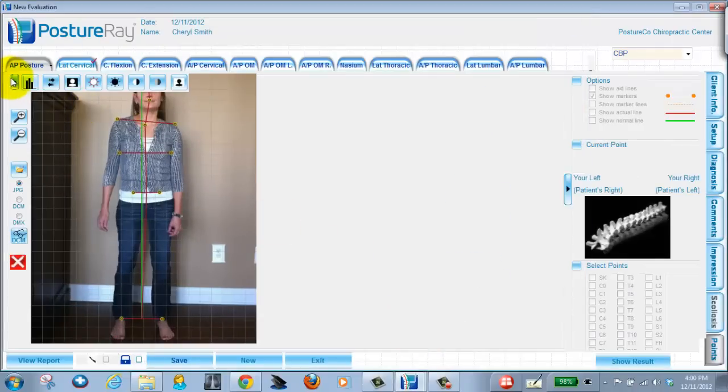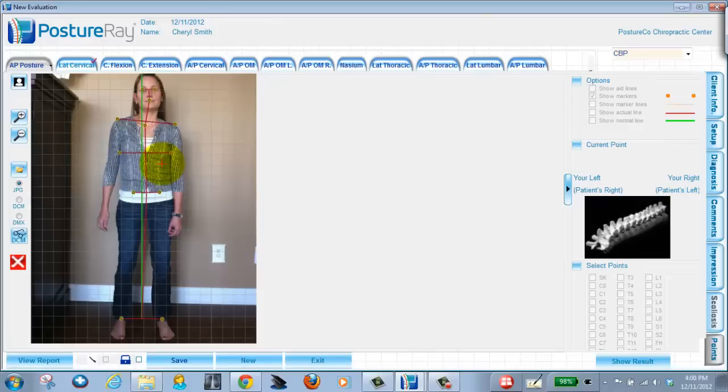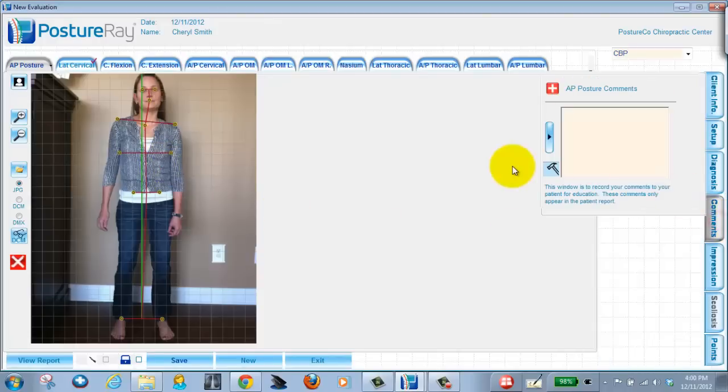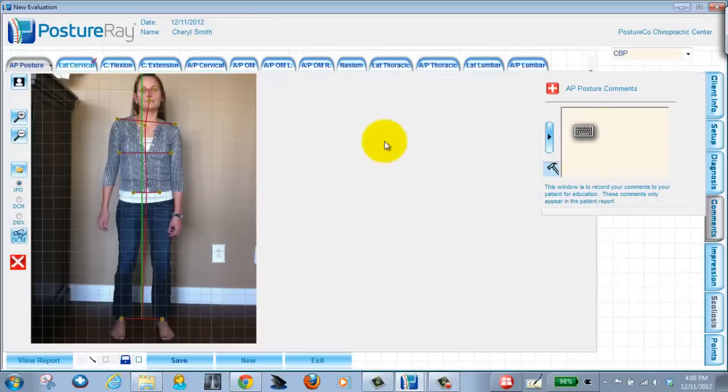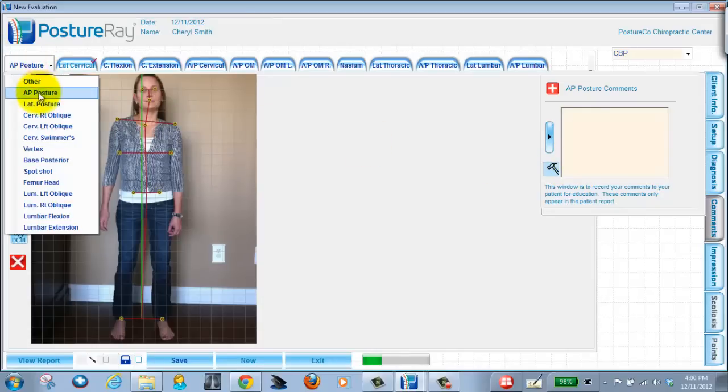Now that exam is in Posture Ray. And if I wanted to make a note to the patient, I could make a note to the patient in here as well, which will show up on the reports as well. So now let's go ahead and do the lateral view.